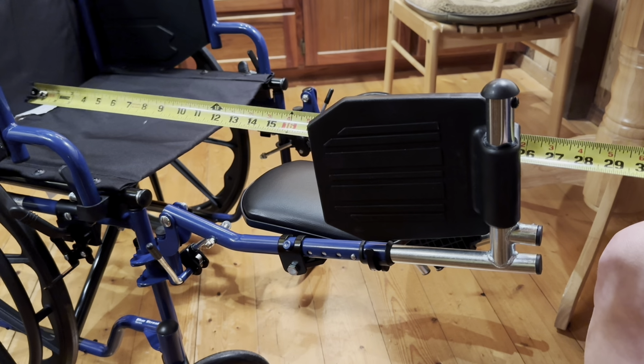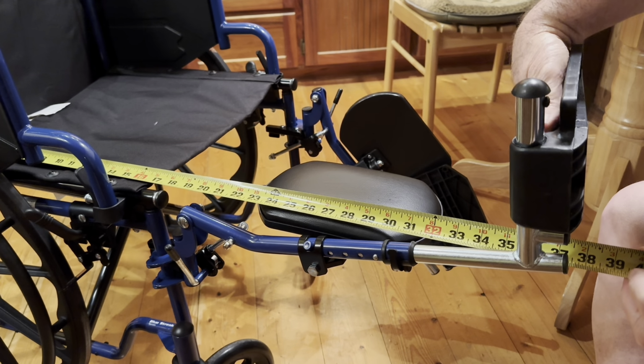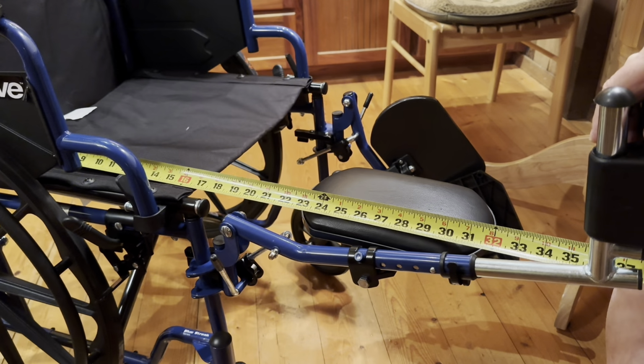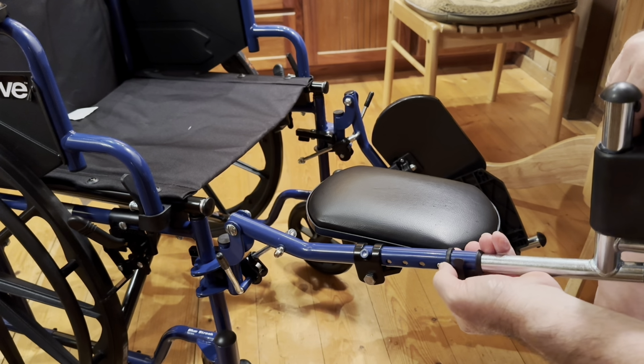So I want to show you what the measurement is. So I'm measuring where your foot would sit, and that back panel where your back would be, it's 37 inches. So furthest out is about 37. Let's push this in.